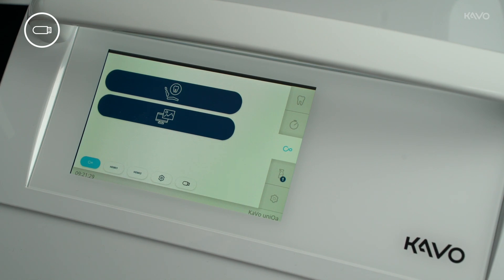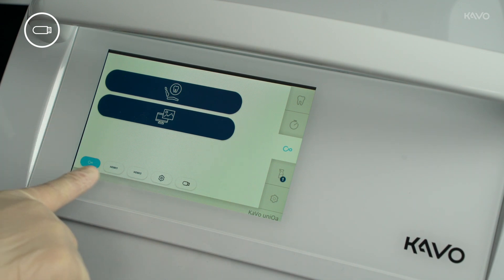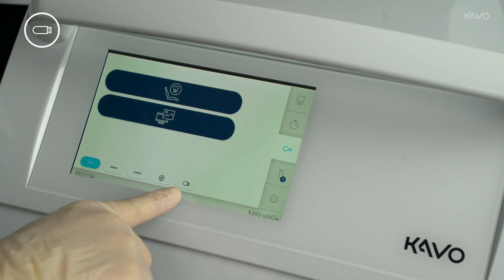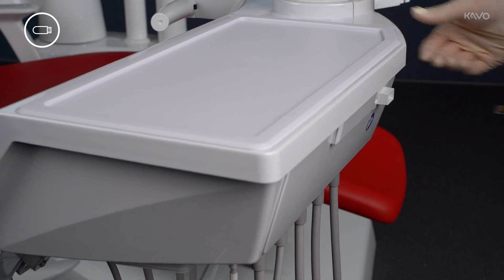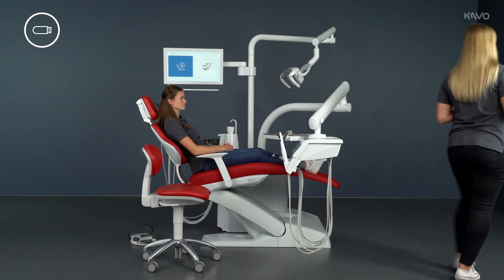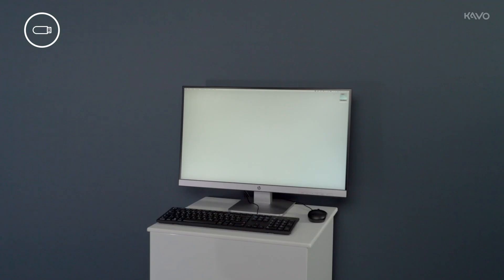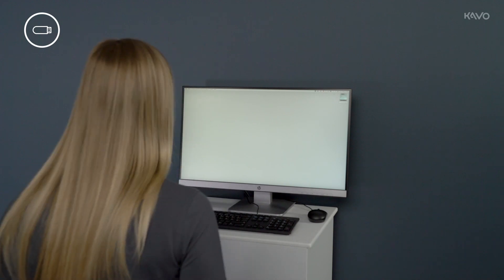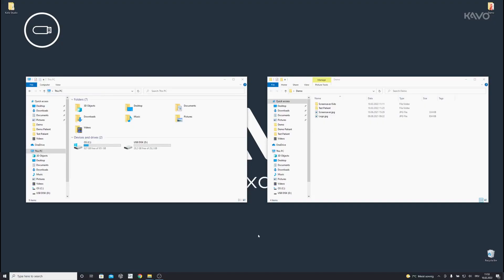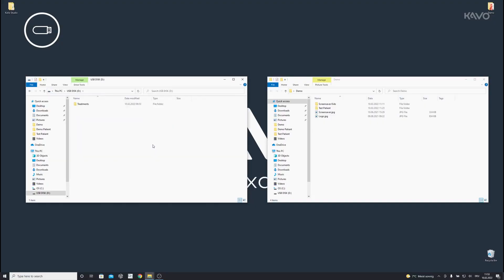If you also want to export the images manually, you can do this by clicking on the USB stick symbol. The images can then be saved on a computer and used further. To do this, insert the USB stick into the computer and open the USB drive — the images are stored in the Treatments folder.